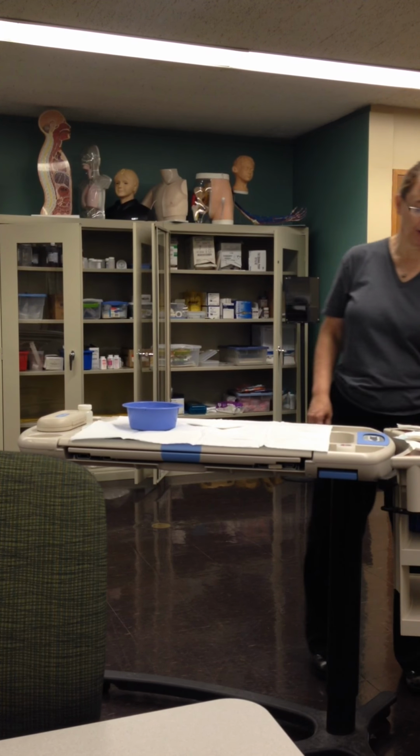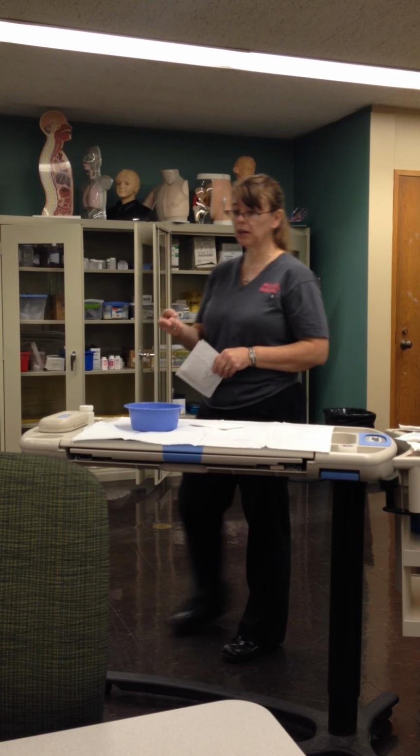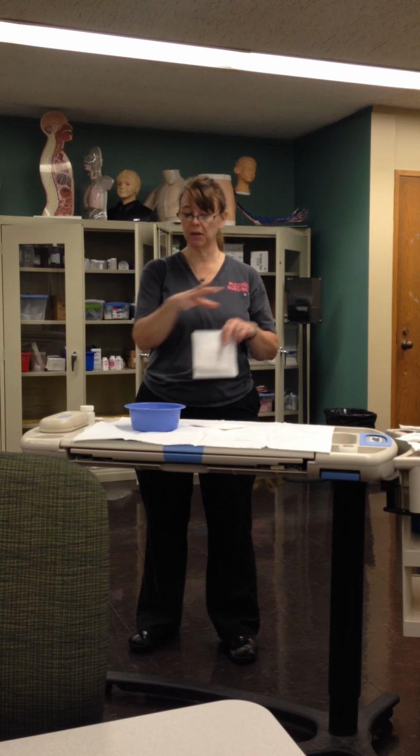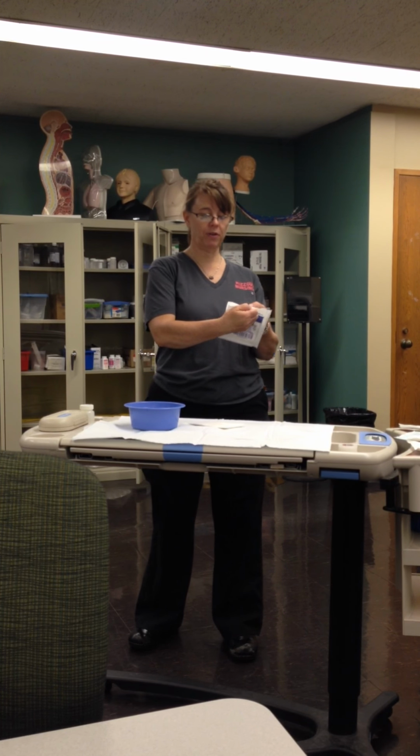Then I'm going to throw my gauze out there. As far as the gauze goes, I can try to get it in my bowl, but I don't have to, because I'm going to put on sterile gloves after this step, and then I can move everything on my sterile field wherever I want it. So I'm going to open it away from myself again.